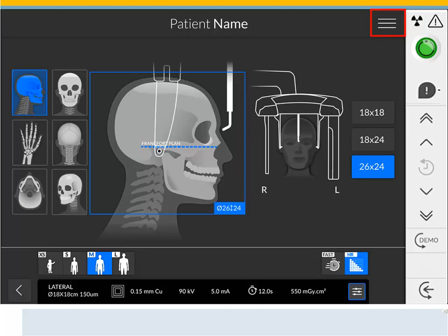Menu provides access to the following sub-menus: General Settings, DICOM Settings, Reset to Factory, Patient History, Shut Down, Restart, and About. All functionality, except for adjusting the unit height, can be performed from the touchscreen control panel and from the workstation interface. Both display error messages and operating parameters.